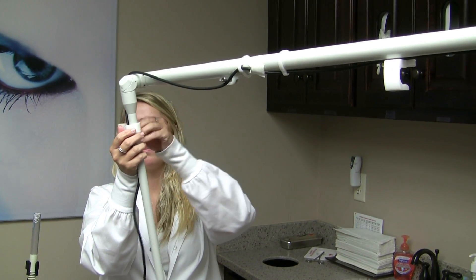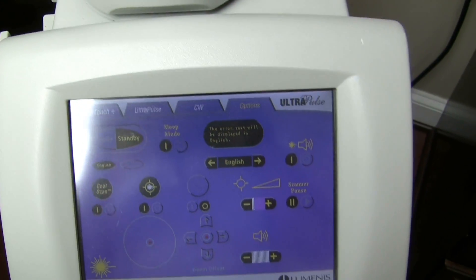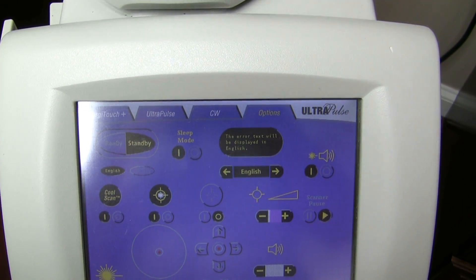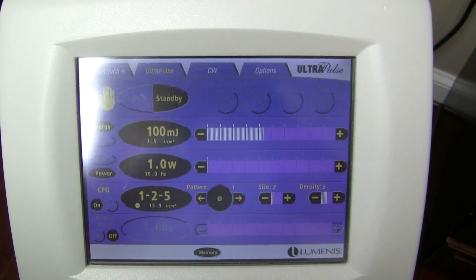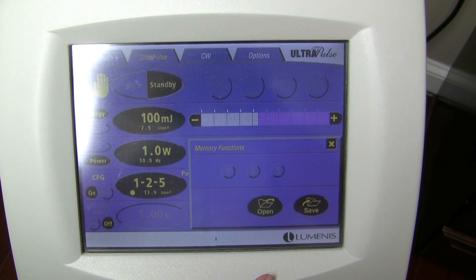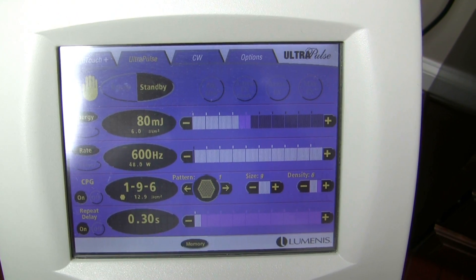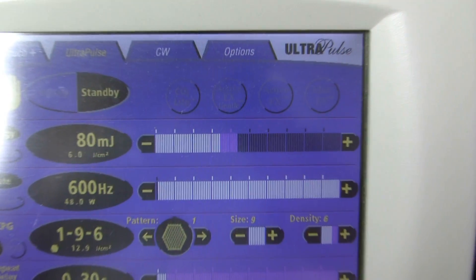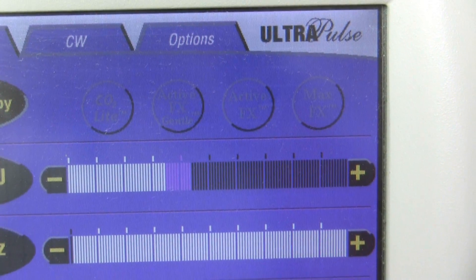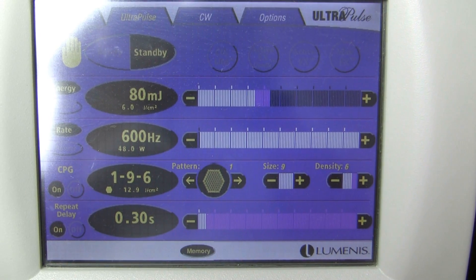Make sure it is level, then come back to the screen and hit the play button where it says scanner pause, go up to UltraPulse — it takes a second sometimes. Then do memory open one, which gives the standard settings for a CO2 resurfacing laser. Up top there are buttons for CO2 light and Active FX, but we don't use those — they are pre-programmed. For CO2 light settings, do memory open two.